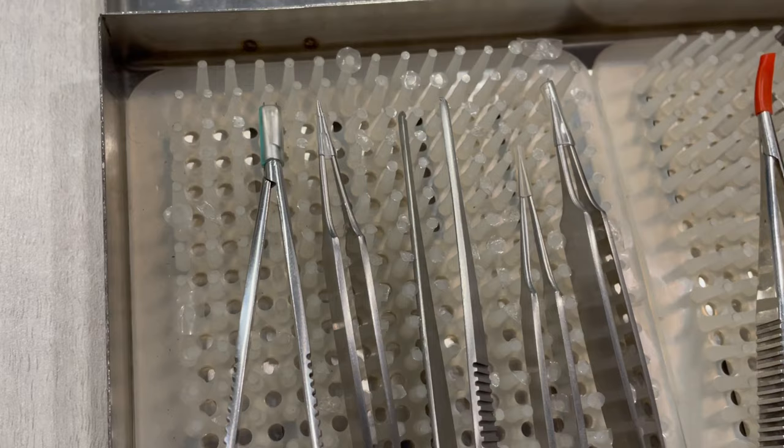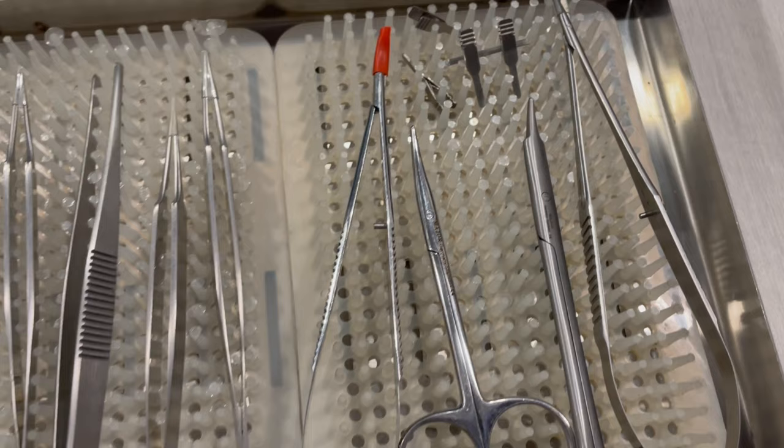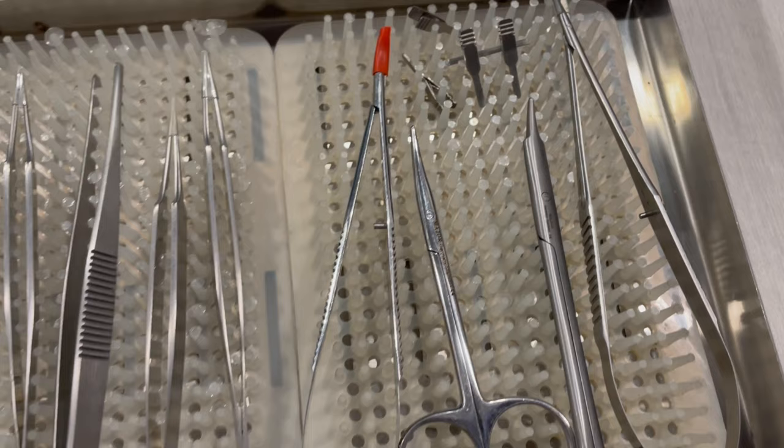This will also be a good time to show you my microsurgical instruments. This is a set of instruments which I carry along. These are very delicate instruments, so it is better to have your own set. These are autoclaved and sterilized before every surgery whenever they are needed. And with the loop, they complete the set. We use the loop and the microsurgical instruments to operate on tiny little structures of your body which actually make a big difference when you come out of the operating room.